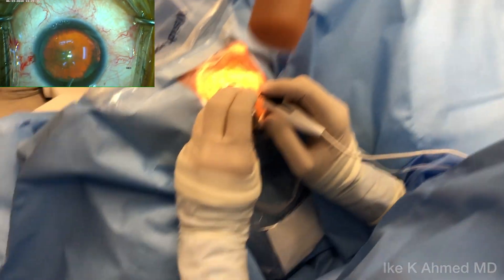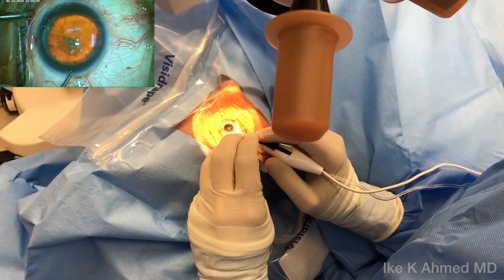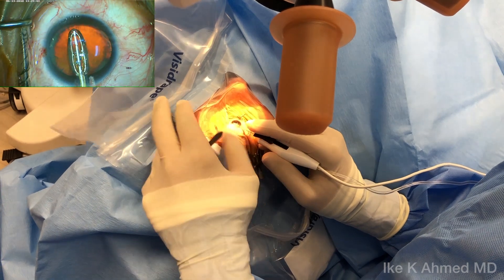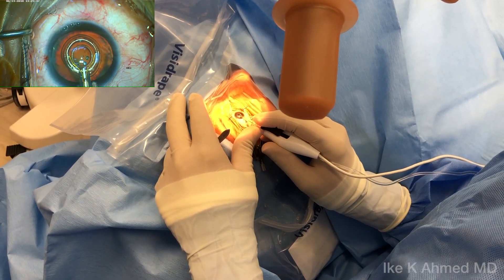Now we'll place the device through the 2.2 mm incision into the anterior chamber. Once we have it in the anterior chamber, we can then retract the pushrod, as you see, partially just to the end of that silicone skirt.